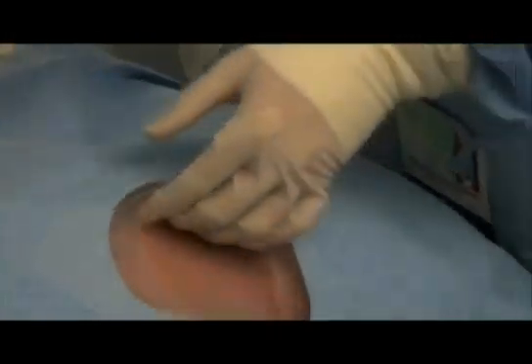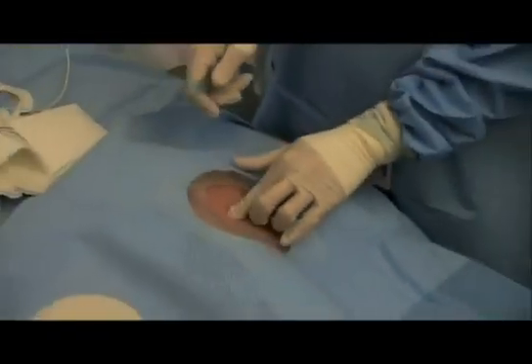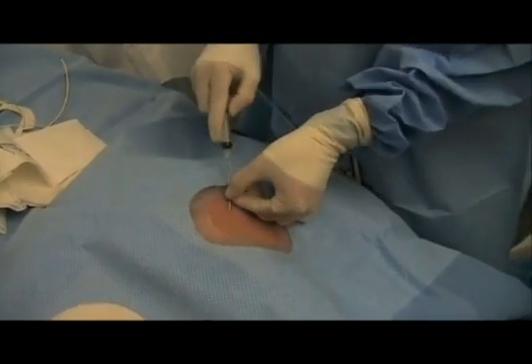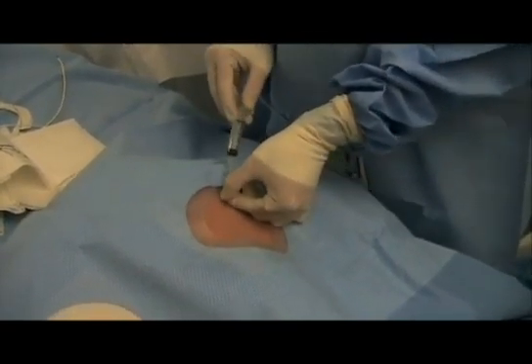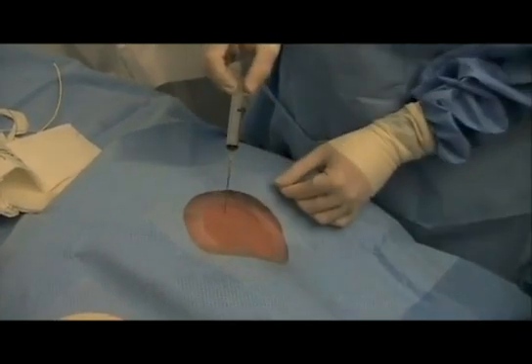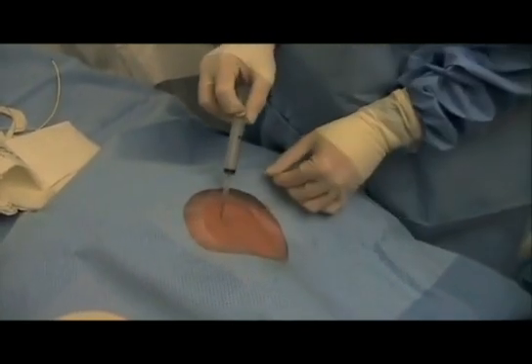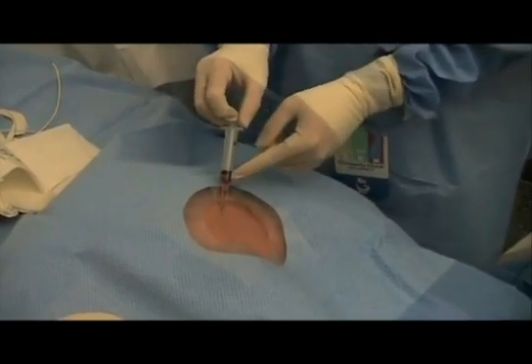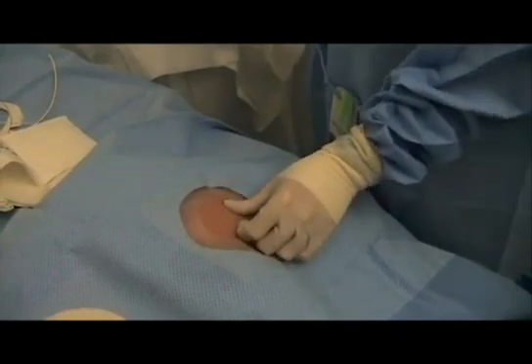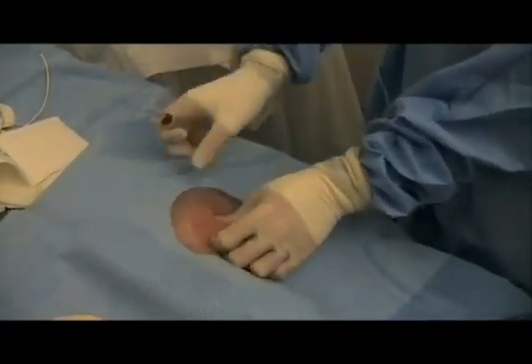If you want to do this the wrong way: find that straight portion of the clavicle, hit the bone, and when you can't get under it you start to raise the hub. Yes, you will get under the clavicle that way, but you'll go directly into either your subclavian artery — which we just demonstrated — or into the lung. So the key is to never move off horizontal.